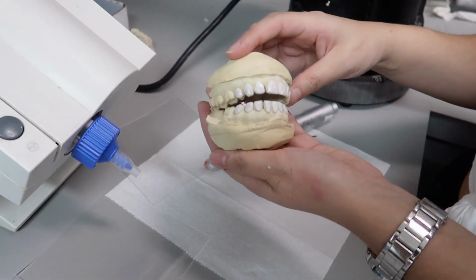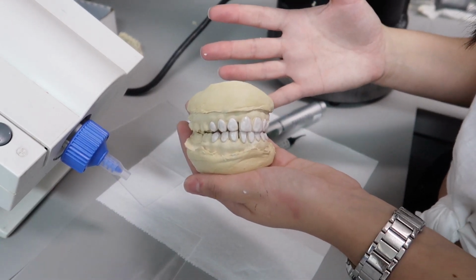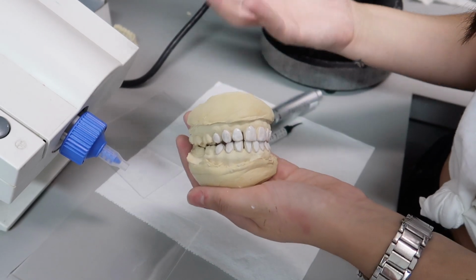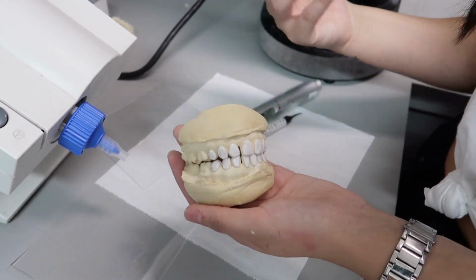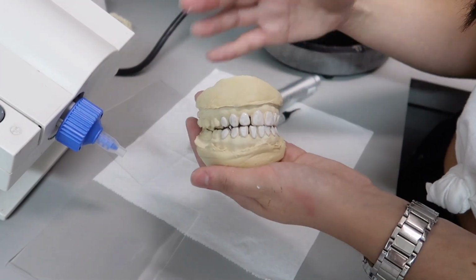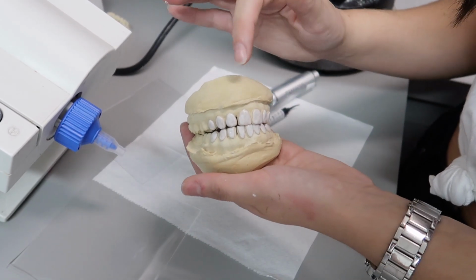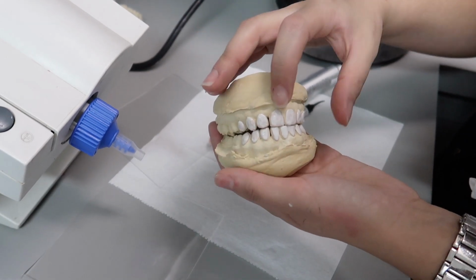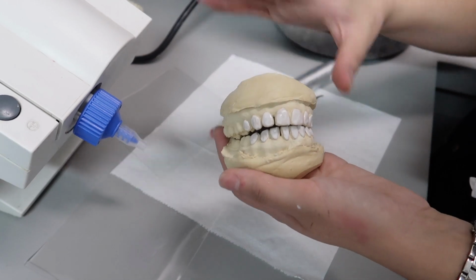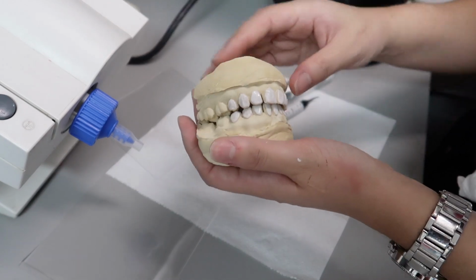This is the finished product, so I did my barriers on top and bottom. And of course, if the patient has a crown or veneer on a tooth, then you don't need to do that, because they don't need to be wasting gel on that tooth, because obviously it's not going to change shades. So you go ahead and skip any tooth that has crowns, veneers, or even a big bonding. For example, this tooth here, number 8, has a composite veneer, and I just put it in here to show you guys, but technically I didn't have to put that there. So that's just extra info.